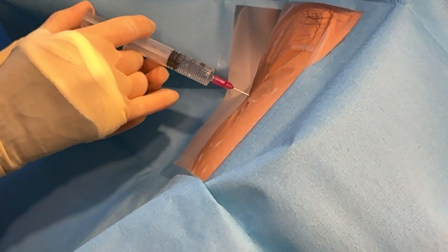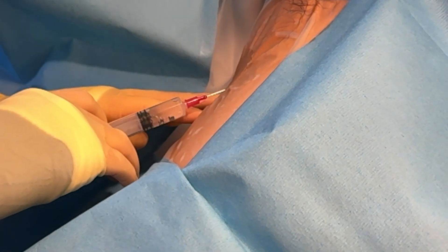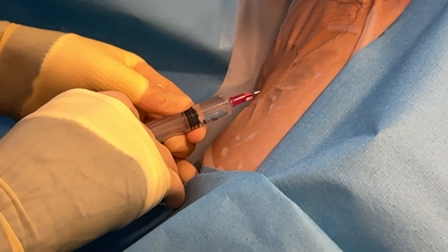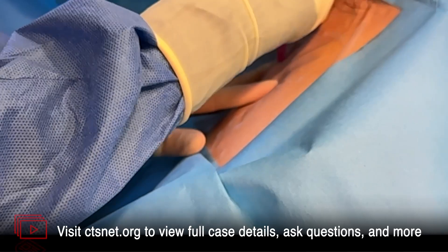Step 5: The provider instructs: 'Just make sure you pull back — make sure you're not in the vessel when you go a little deeper.' A wheal of anesthetic is raised: 'I'm going to raise a nice wheal for you. I'm going to put a lot in there.'